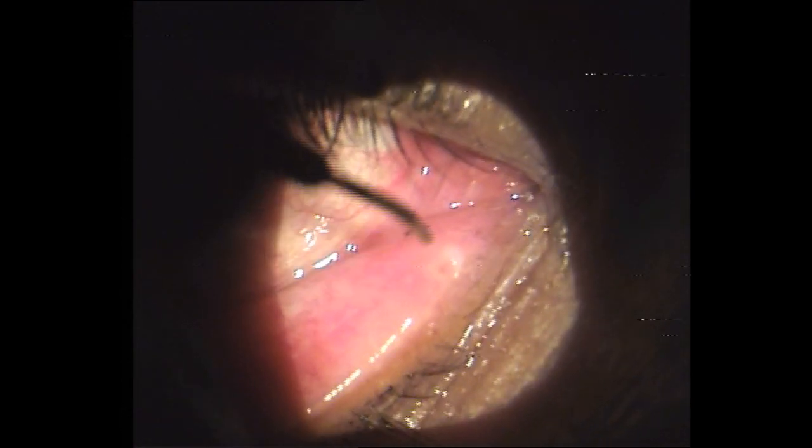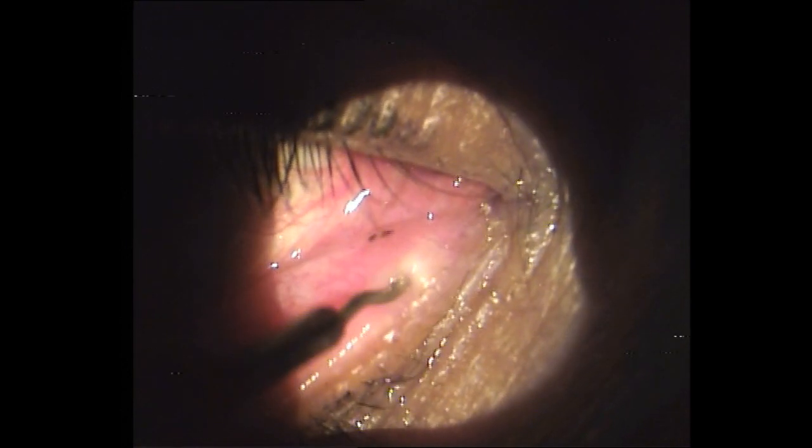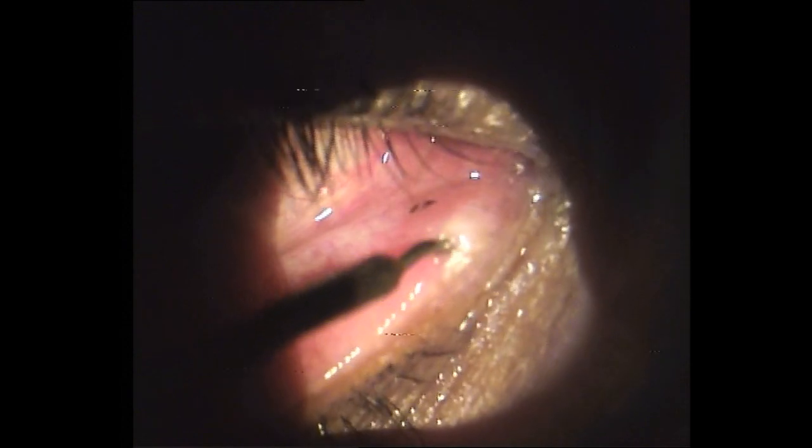Then you would come in with your syringing, and for that you need a lacrimal cannula. Here the lacrimal cannula has been slightly modified so that it easily goes into the nasolacrimal passage. Here you can see I'm doing it on a slit lamp, so it easily goes in, and you just inject it, and there's no reflux from the upper punctum. So that tells you that the patient's lacrimal system is open completely on the right side.